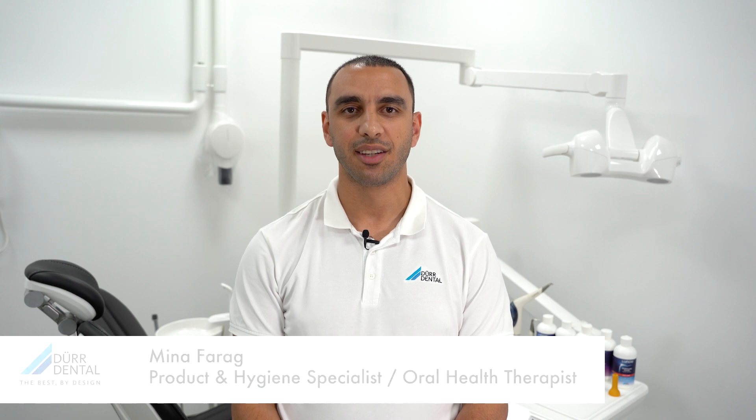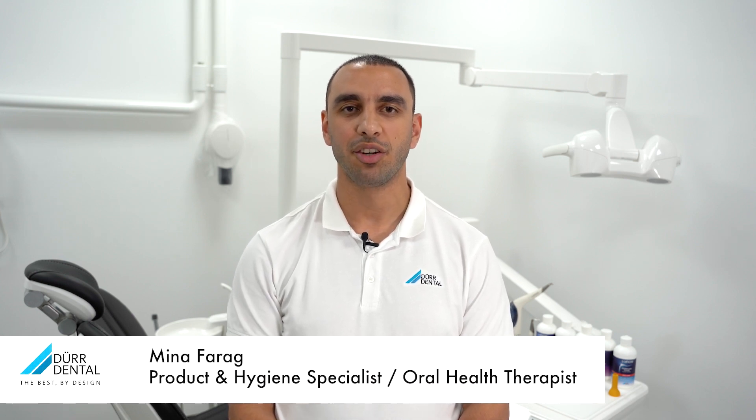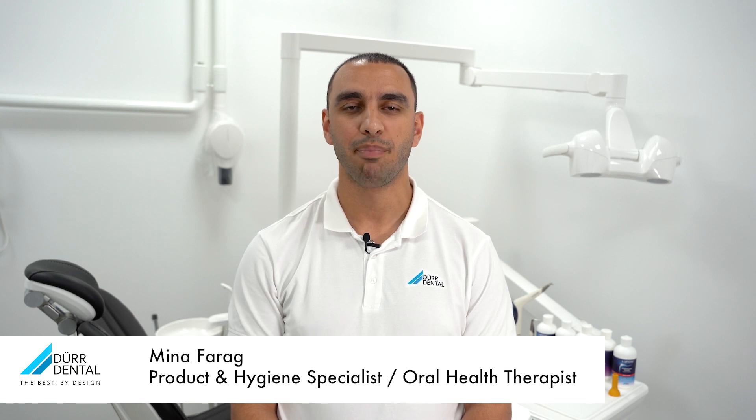The MyLunos powder jet device is used for the mechanical removal of plaque and stains using a combination of air, water, and powders based on trehalose. It features an award-winning design by Dürr Dental and is manufactured in Germany.